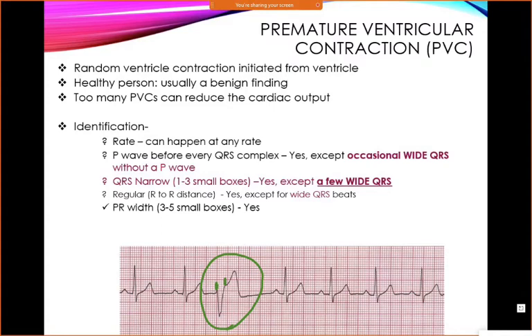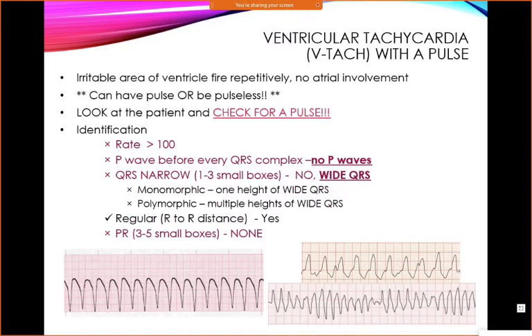But any ventricle rhythm, the QRS is wide and weird. It's not narrow, normal like the rest of them. This is wide and weird. So that's just a random one. And then here's a whole bunch of wide, weird ones. This one's VTAC. They're all wide, they're all weird, but it's pretty regular, right?